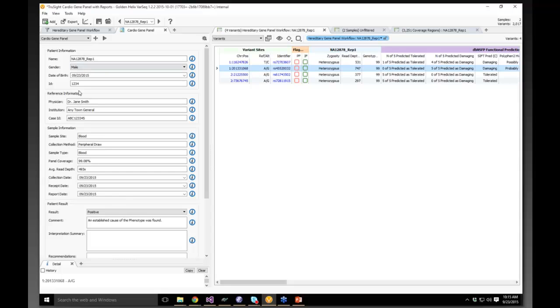And it pulls in information about the sample that you're currently looking at, and we can have a lot of this auto-filled in from things that are computed from the project, such as these target regions. These are actually the coverage regions, read depth and panel coverage that we just computed and we're just looking at for the sample. And you can even pull in some other information if you, on import or through VS Pipeline's automation, applied extra field information to the sample level.